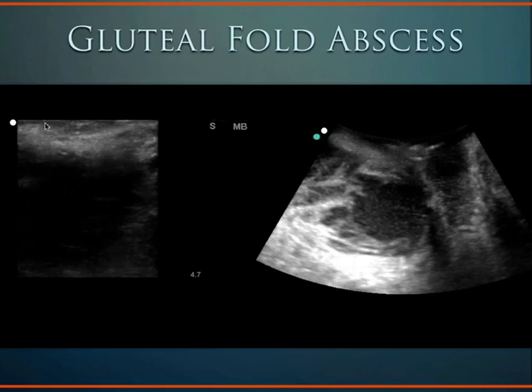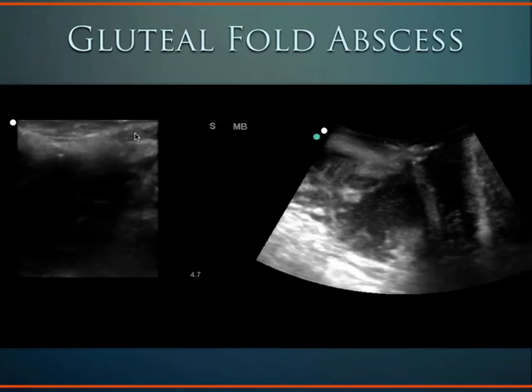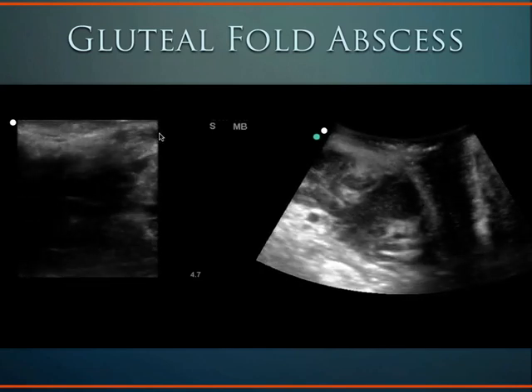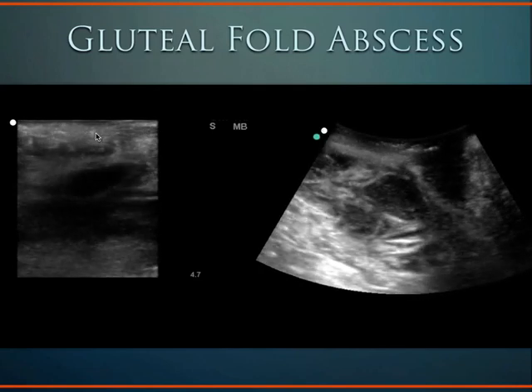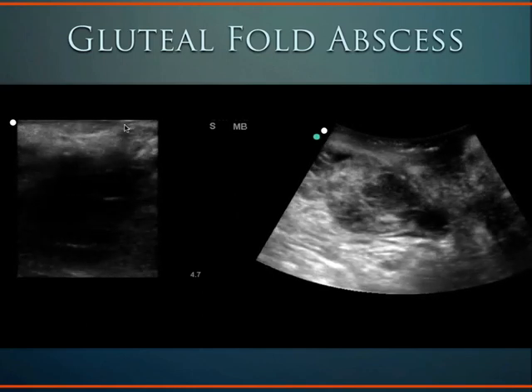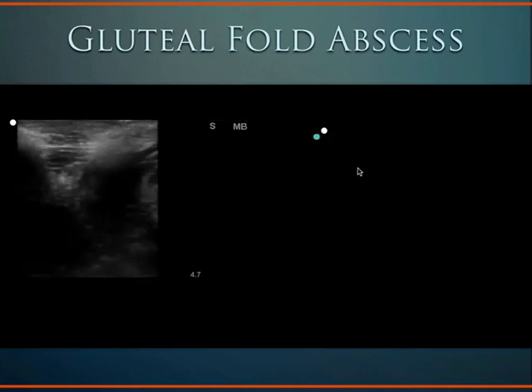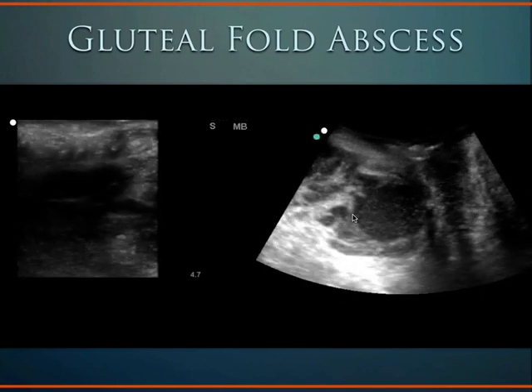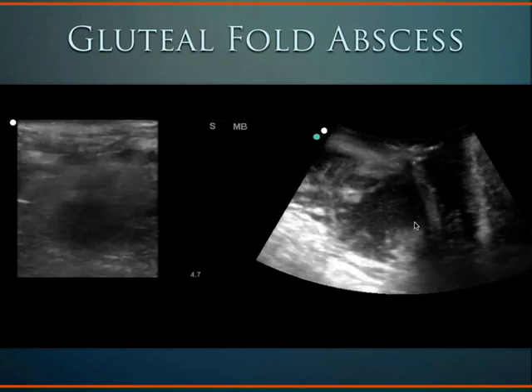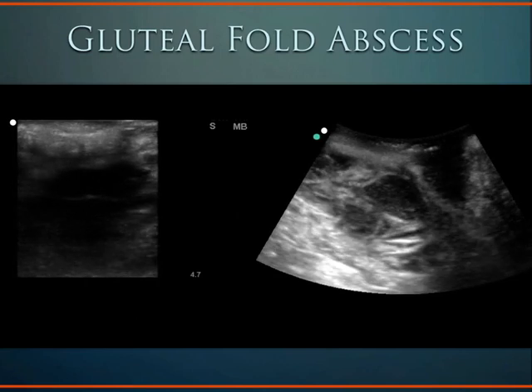Interestingly, on the skin line, there was no evidence of any cobblestoning or cellulitis at all. Just normal sort of soft tissue here. No evidence of cobblestoning. His skin wasn't even red. He just complained of severe low back pain. In fact, the resident taking care of the patient ordered some x-rays which were negative. They didn't see any evidence of abscess on the x-rays, which you wouldn't expect to. The bones looked okay, but it wasn't until we did this ultrasound that we saw he had this severe abscess there.